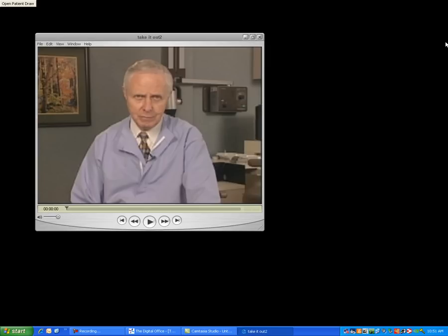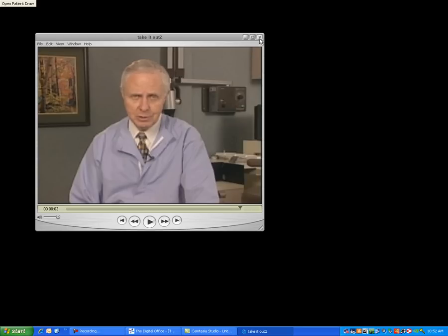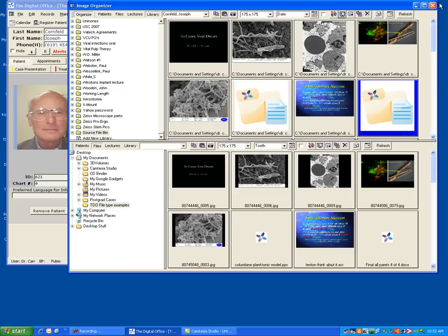Click my mouse to open up the next item. Now this is a video from the web of Dr. Christensen's famous clip. My suggestion, take it out. Close my video. Click my mouse. That's the end of our presentation, so it brings us back to our image organizer.